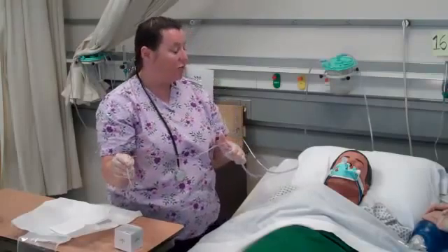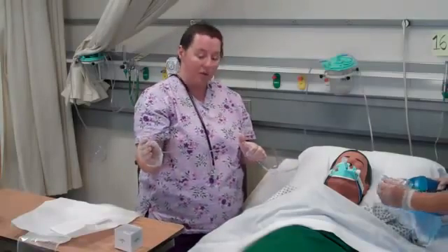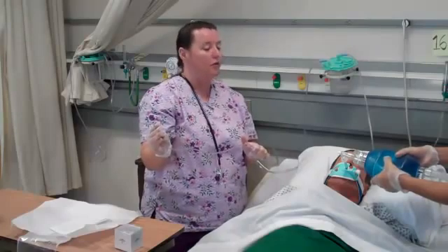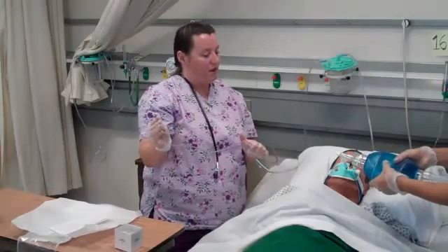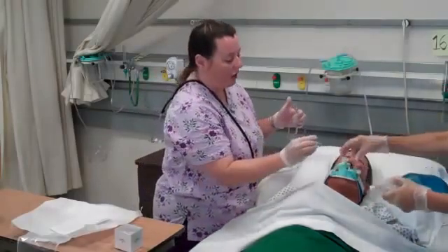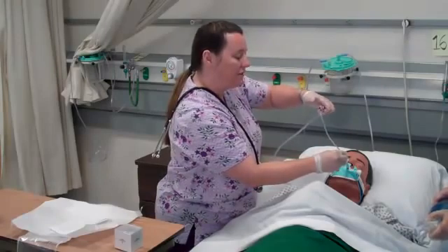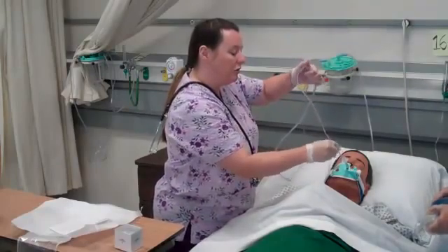I'm ready to suction, but first my assistant is going to hyper-oxygenate the patient — giving 100% O2, not hyperventilating. The oxygen source is on full flush and she's going to give a couple of extra breaths. She then removes the patient from the source. I go straight down the ET tube maintaining sterile technique, not touching my hand to the tube, until I hit resistance or the patient starts to cough. I pull up one to two centimeters and apply intermittent suction as I withdraw the catheter.